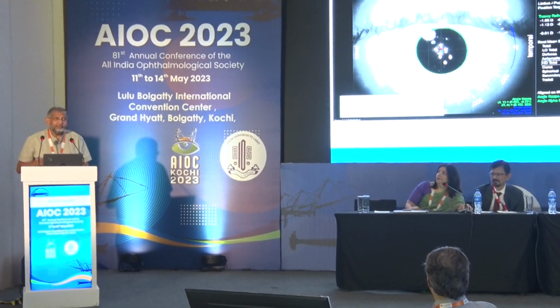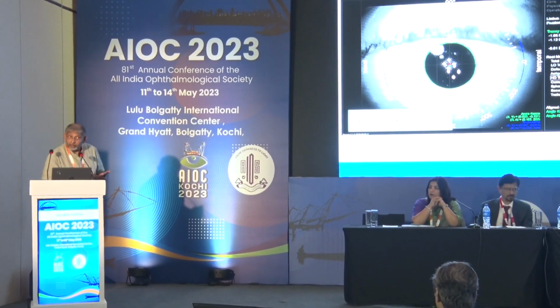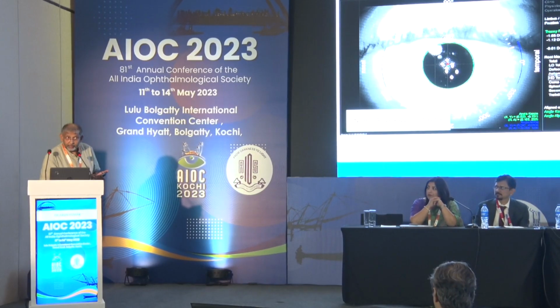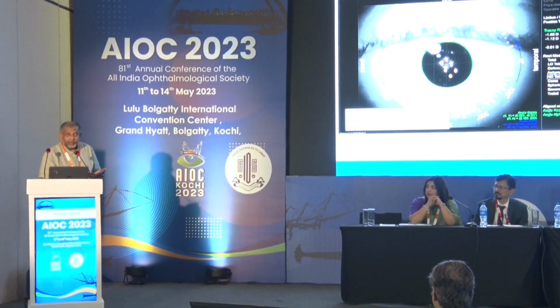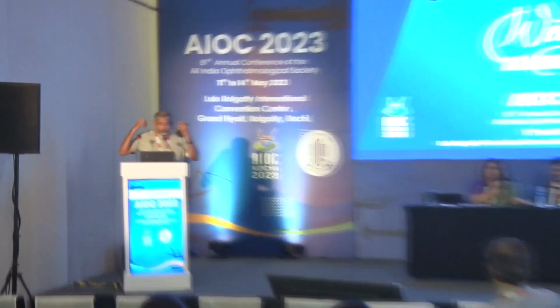Should eye tracing be done in an undilated pupil or a dilated pupil? It should be done in an undilated pupil, because that is the functional one. Once we do an eye trace, we go through scotopic vision, mesopic vision, and photopic vision. All are part of our daily life. Dawn and dusk is mesopic. Scotopic vision is night vision. Even for post-operative analysis for toric, it can be mid-dilated; for the toric check we require dilated.